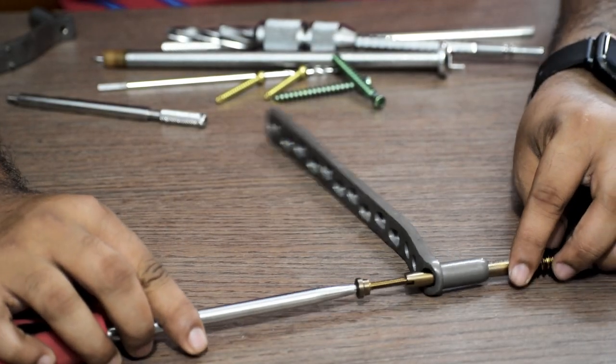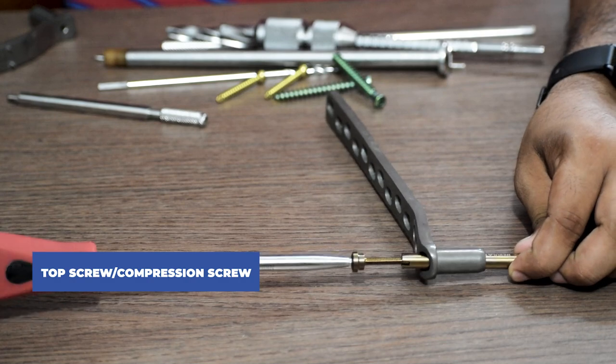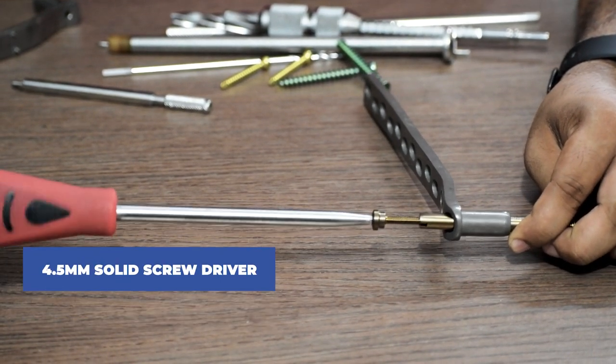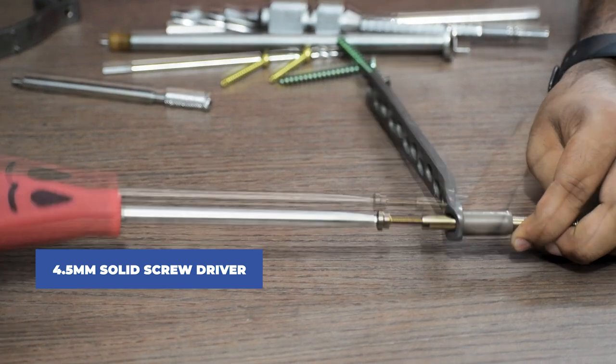After this we connect the top screw or the compression screw in this end of the lag screw with the help of a 4.5 mm solid screwdriver.